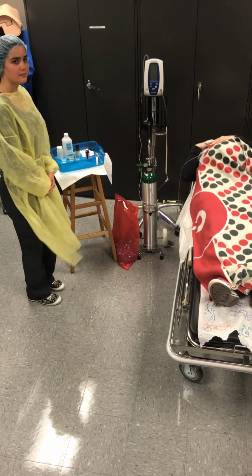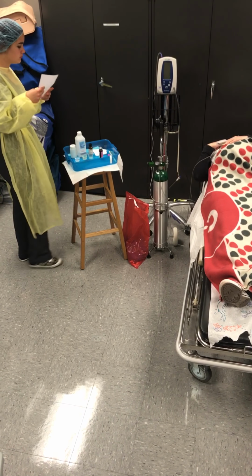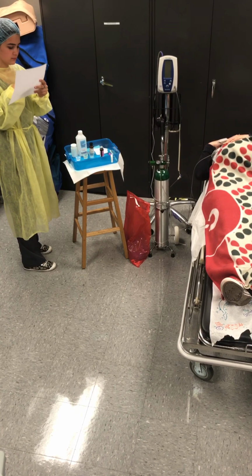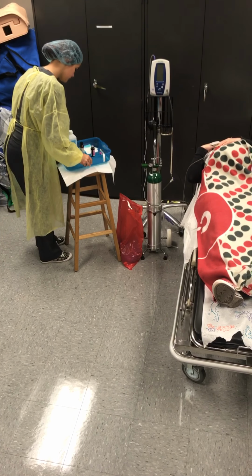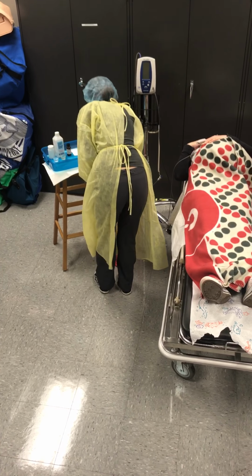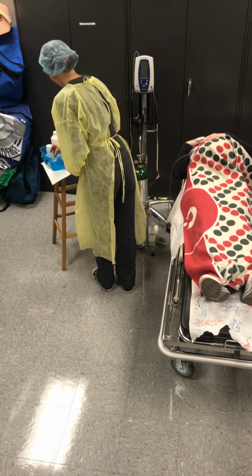Paying attention to detail, complete the laboratory requisitions. Dispose of equipment per OSHA. Accurately record procedure.